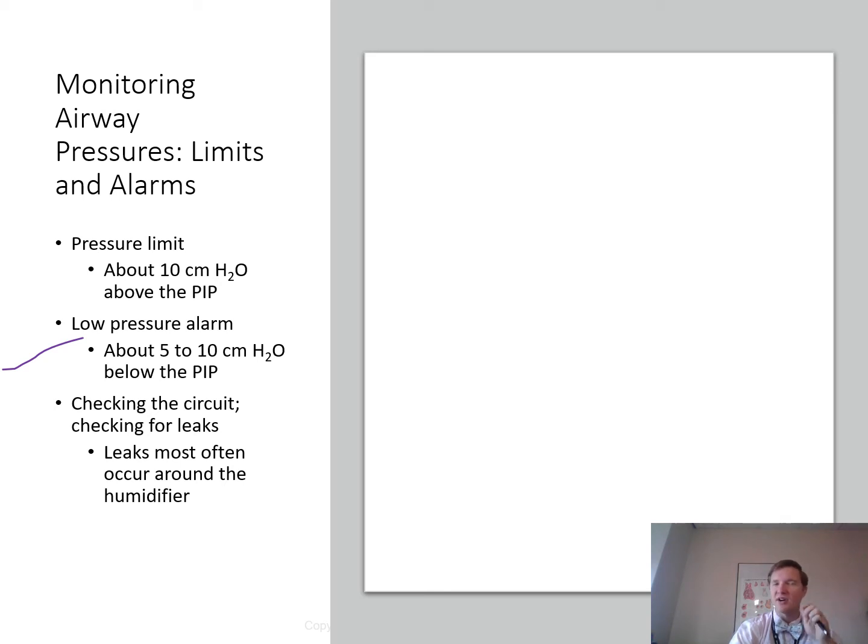Leaks most often occur around the humidifier or through humidifier water-fed lines, water traps, anywhere tubing connections join. So there are other possible sources like the closed suction catheters, the Ballards if you will, inline thermometers, end-tidal CO2 monitors. A normal leak might be around the ET tube if they're using minimal leak technique, back from critical care, used to inflate the cuff. But the leak that's associated with minimal leak technique usually is insignificant. Very little volume is lost in adult patients.